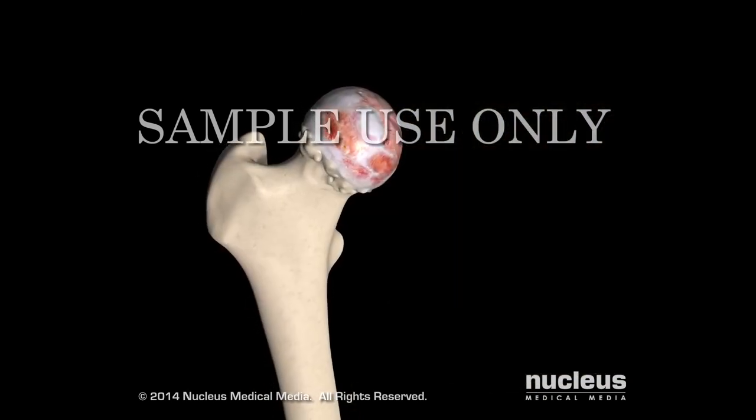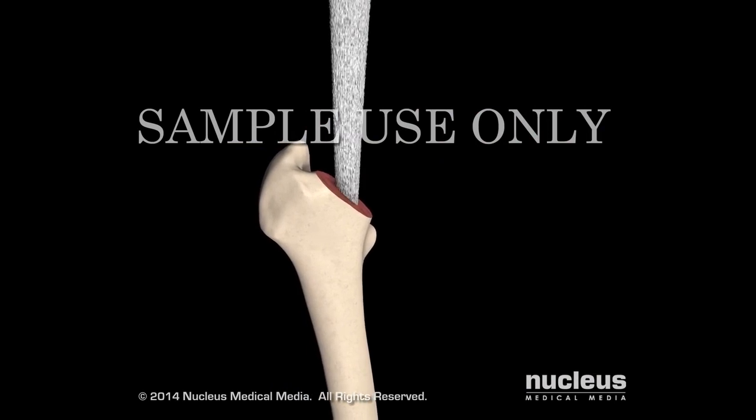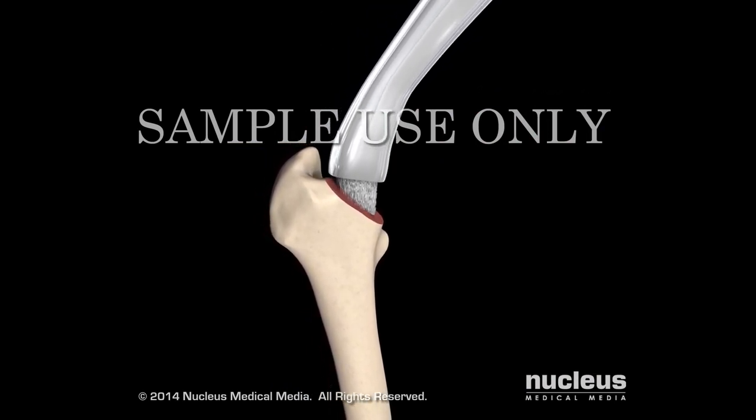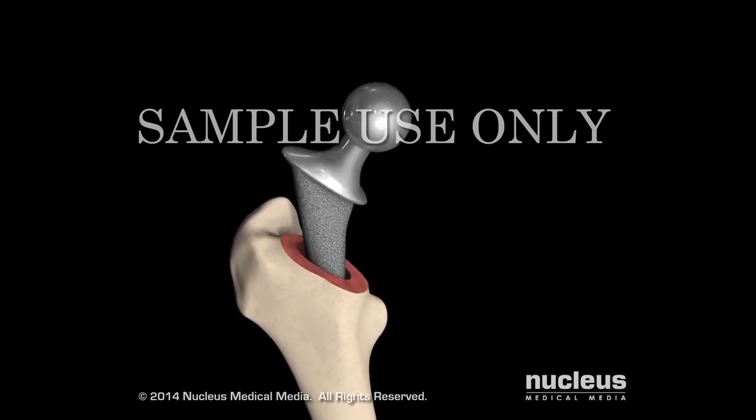Turning next to the femur, your surgeon will remove the femoral head, shape the remaining femur to fit the prosthetic stem, and secure the femoral component using cement or other techniques.